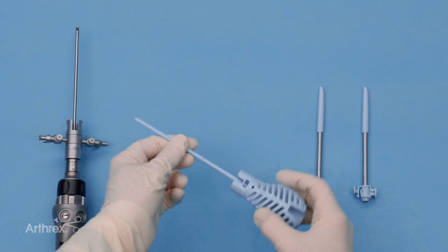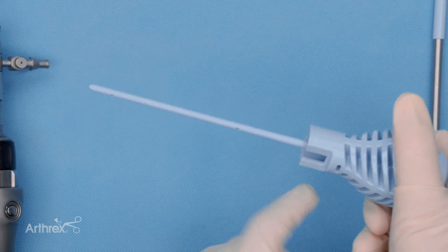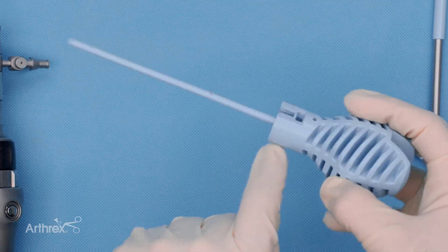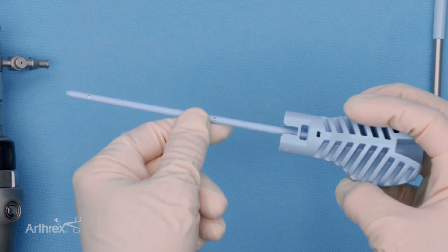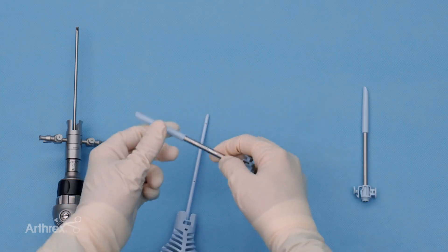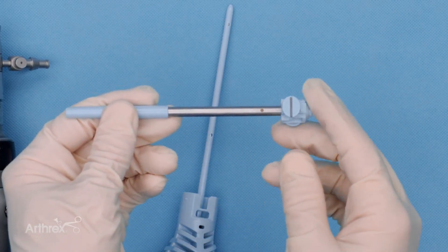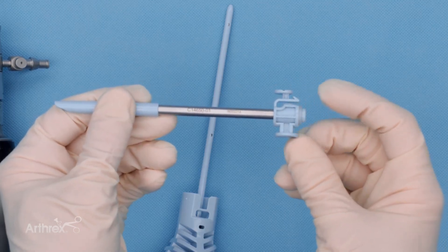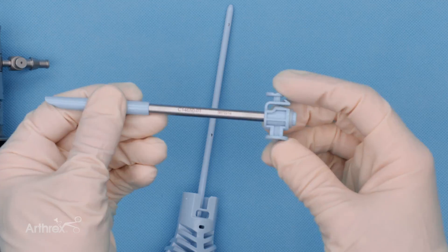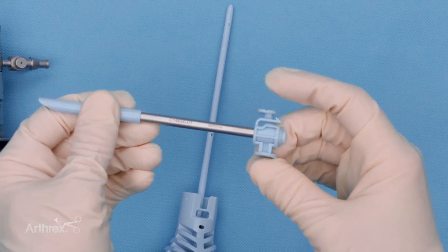Looking at the actual obturator, we've pointed out the chin-up bar construct, and if we roll this over you can see the U-shape construct. The key is to remember there's nothing to click into on the U-shape side, so we're going to use the chin-up bar to hold the flush fit cannula in position. The flush fit cannula is clearly marked so that when you're in the operating room you know exactly what to do. Looking at the release mechanism, you can see that hook that goes over the chin-up bar cutout. When pressing the button, we press towards the surgeon's hand side to get that levering to release.